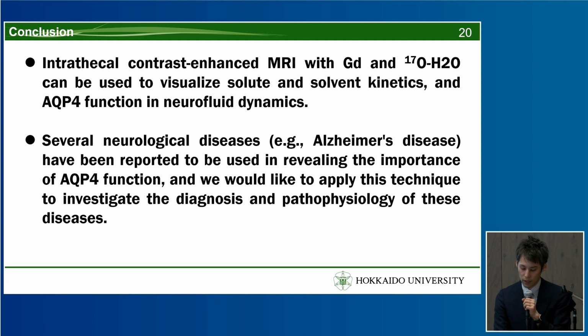In conclusion, intracisternal contrast-enhanced MRI with gadolinium and O17-labeled water can be used to visualize solute and solvent kinetics and AQP4 function in neurofluid dynamics. Several neurological diseases have been reported to reveal the importance of AQP4 function. Hence, we'd like to apply this technique to investigate the diagnosis and pathophysiology of these diseases.